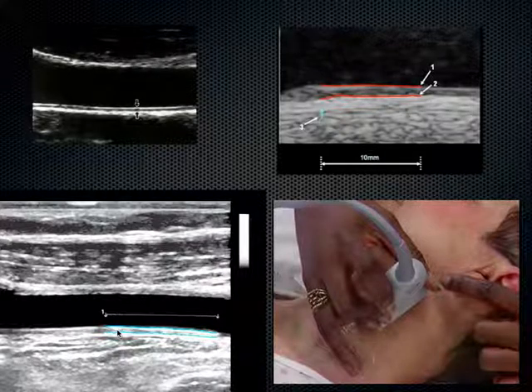Pretty easy to do, but you've got to blow it up to drop your calipers just right. Here we really enlarge this view. And you try to estimate it along a length of about a centimeter.